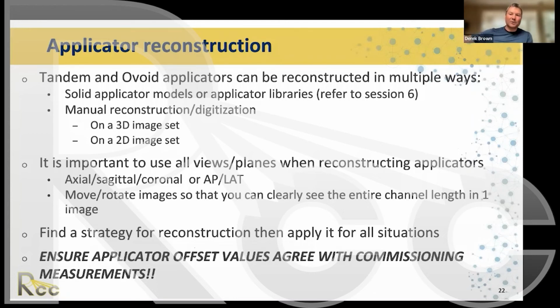All that effort that you spent doing this 3 hours of digitization and 2 hours of dose optimization, you have this wonderful plan, and it's not even close to what your patient gets because they've pretty much crawled across the room and away from the Tandem and Ovoid, right? So it's very, very important that you get good at this before you do it in a patient. That would be a really important message for me.